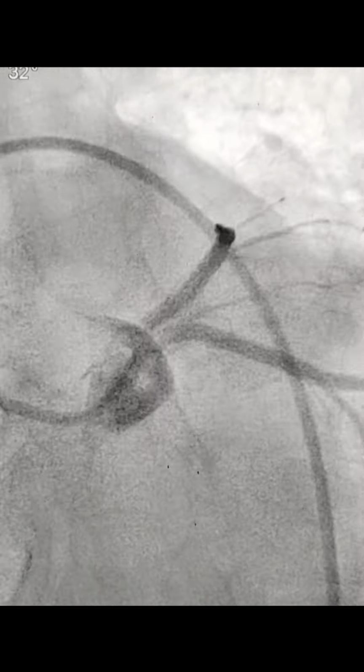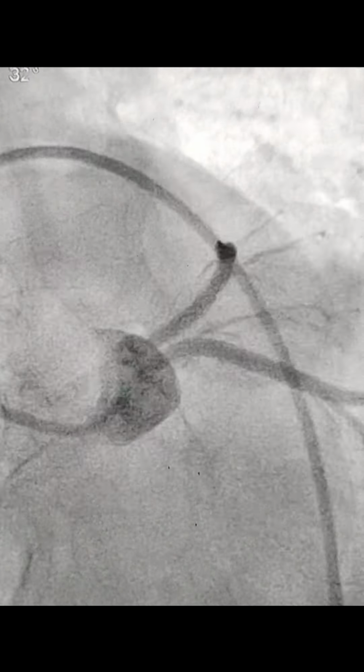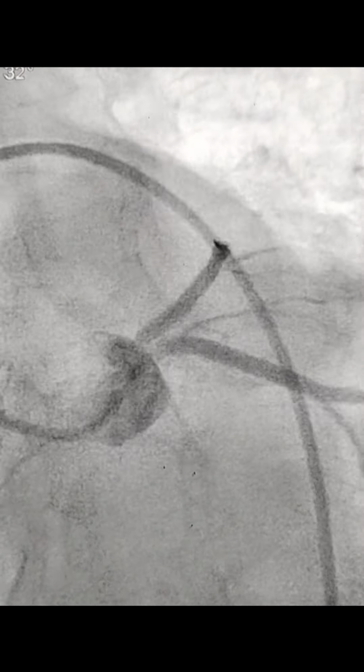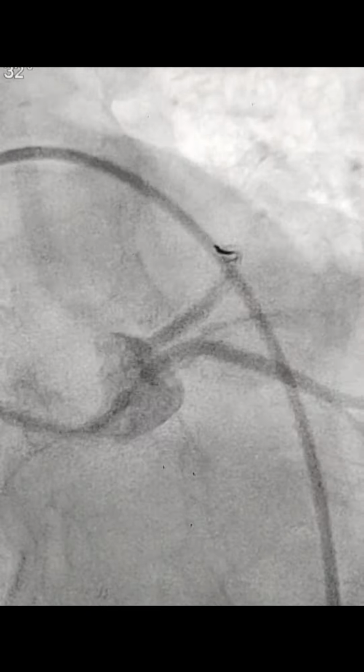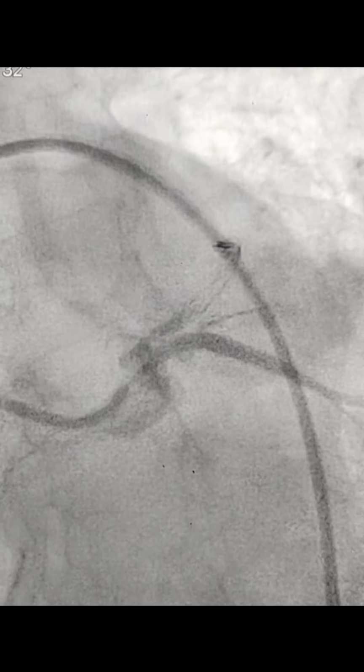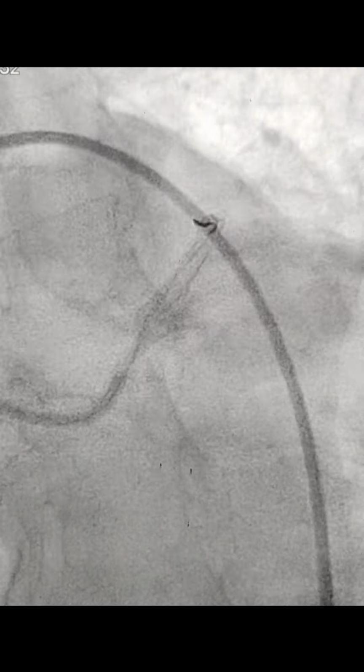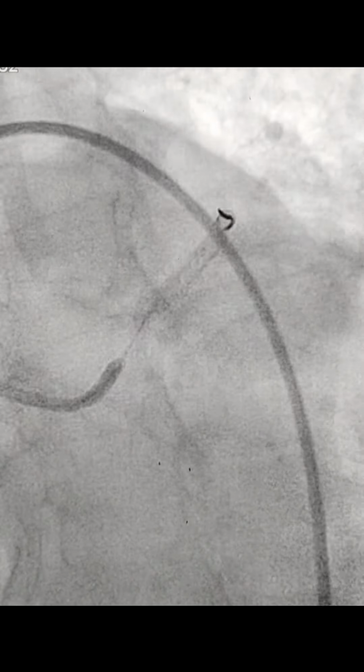And then we could do the procedure. Very difficult to pass the wire. This was sort of organized thrombus. This wire was a BMW PTCA wire. So this was the complex primary angioplasty to separate origin LAD, which was occluded right from the ostium.